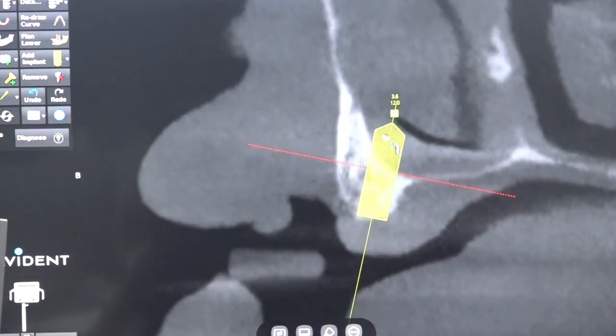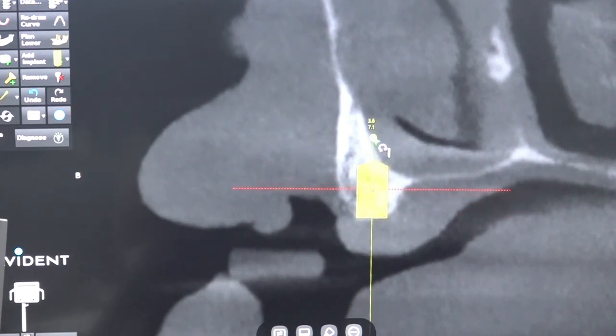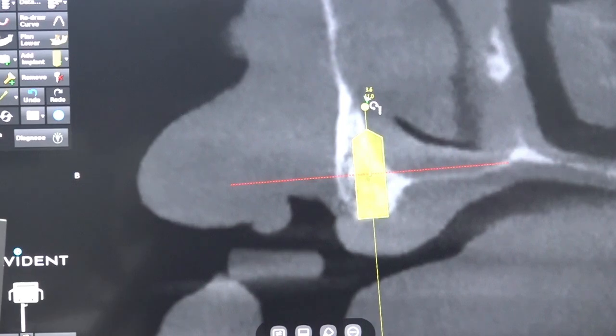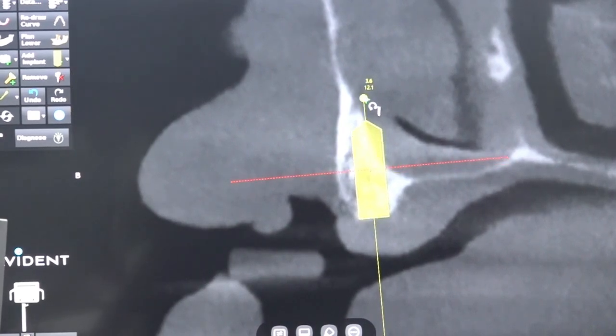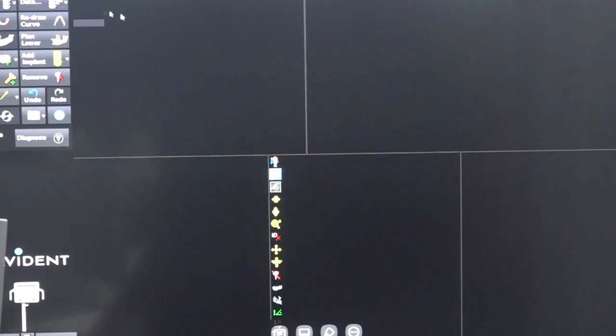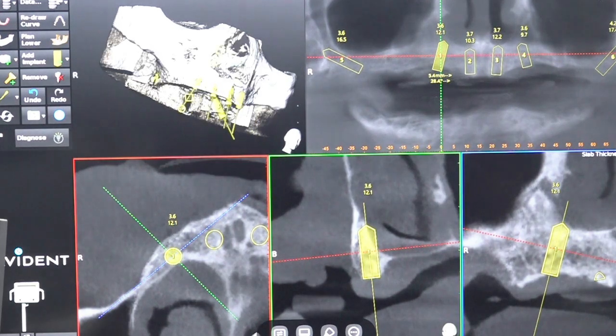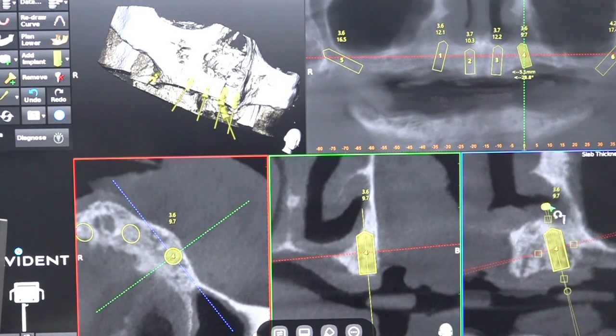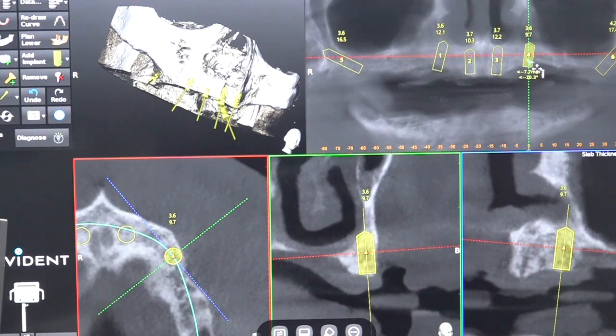If we drill palatally, we will be placing only a 6 or 7 mm implant. So we have to be careful coming towards the labial aspect. Some part of the implant may be exposed towards the nasal floor, that is okay. Maybe a 12 mm implant we can place. So it is a highly challenging situation. The left side is also very similar, but actually worse.